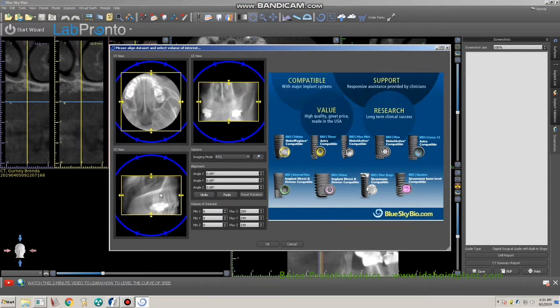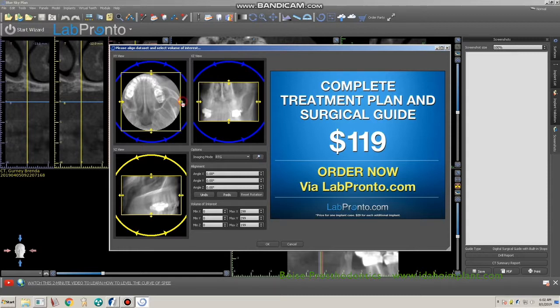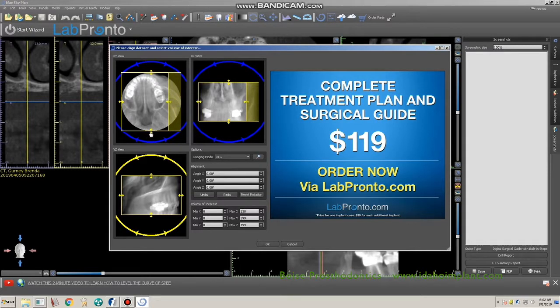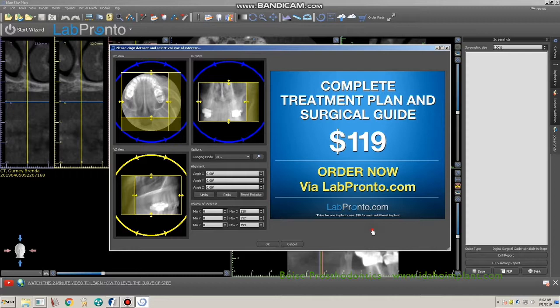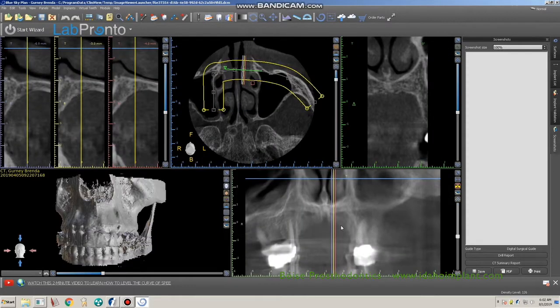You can change the field of view of the CT scan if you would like by shrinking, resizing, or rotating the image. Once you're ready, click OK.